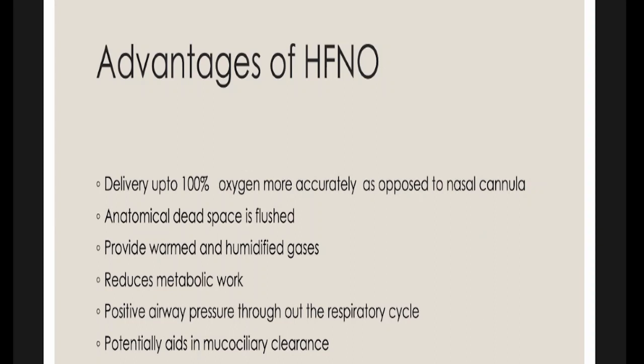Malisha, can you answer me, please? 4 liters. Yeah, maximum is 4 liters. Okay, what happens if you go above 4 liters? Can damage the nasal mucosa. Exactly, yes, good. And what is the problem with nasal cannulas? So it dries off the nasal mucosa, and what else? Because of a lot of drying, again it can cause bleeding.